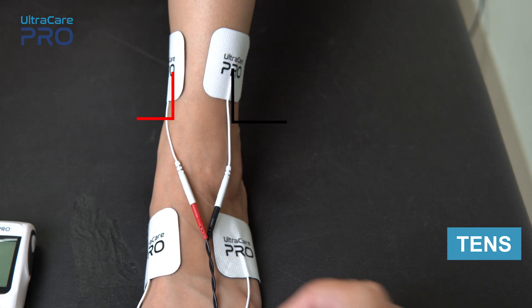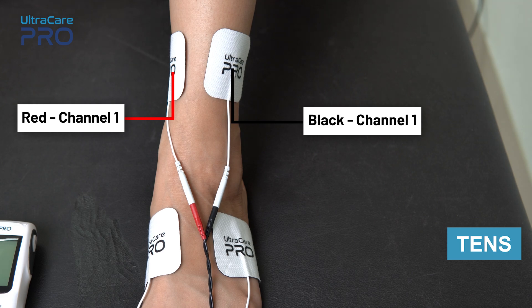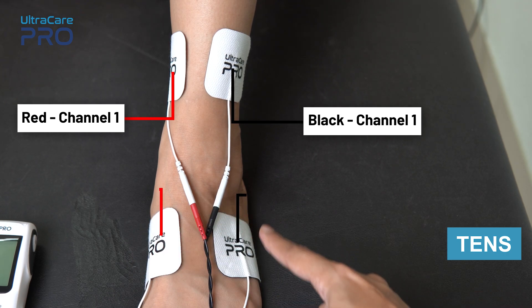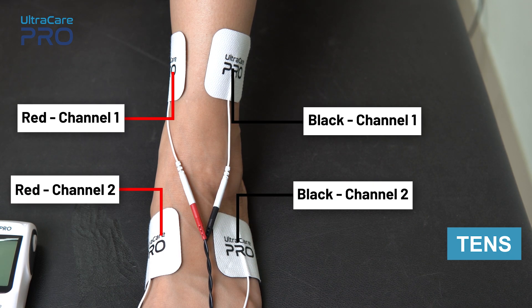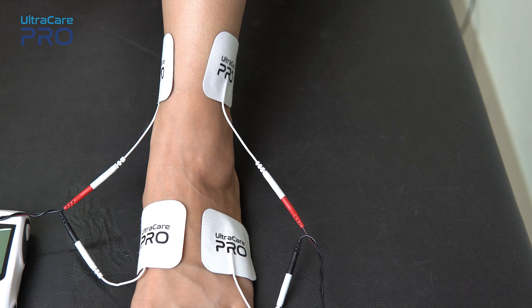For TENS application, place the red and black electrode from channel 1 on the upper side of the ankle joint. Similarly, place the red and black wire of channel 2 on the lower side of the ankle joint, in a way that the painful area gets covered well.